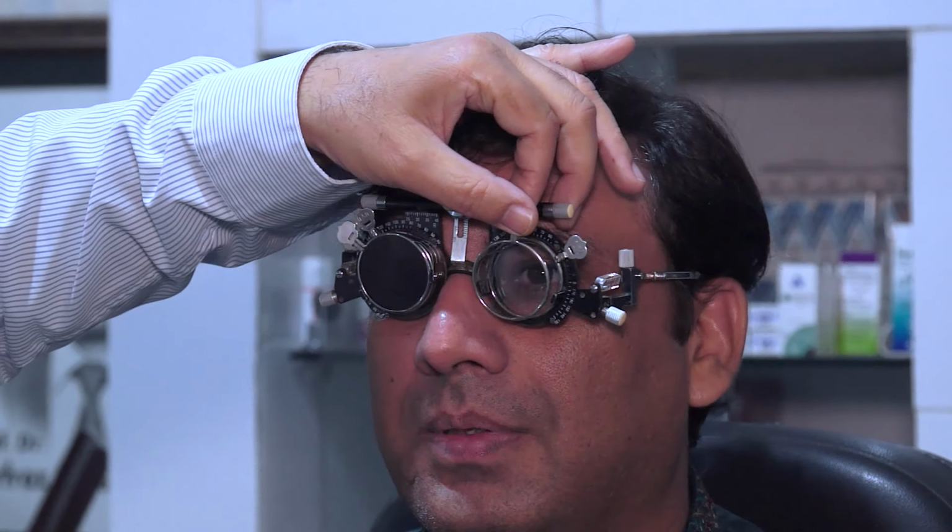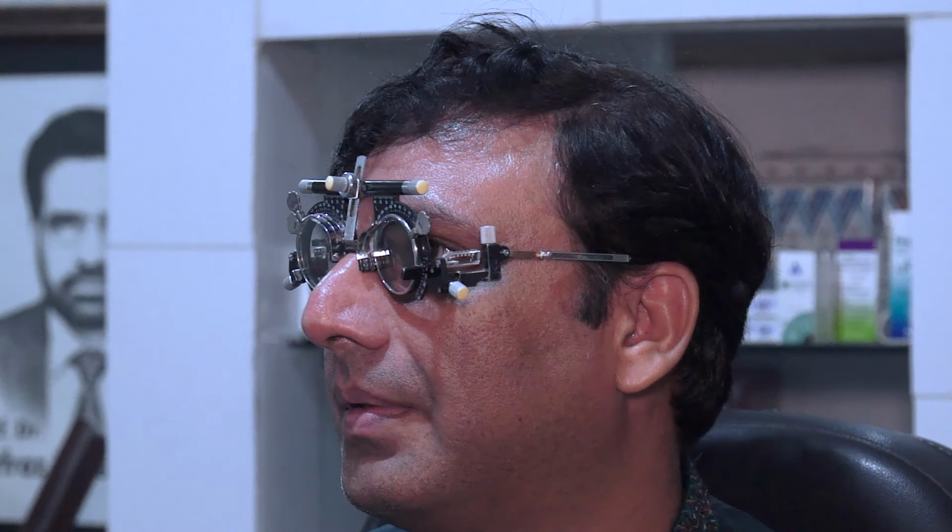The last line, please. OHPNF. Now we need to put the previous one. The previous one is better. Okay, fine. So this is almost the final. Okay, now can you read the bottom line? OHPNF. Okay, can you now see in the room? Do you have any problem? No. Do you feel any strain on your temples? No. I am feeling well. Okay, good.